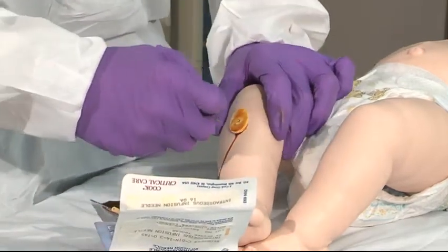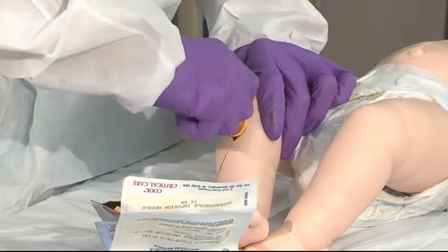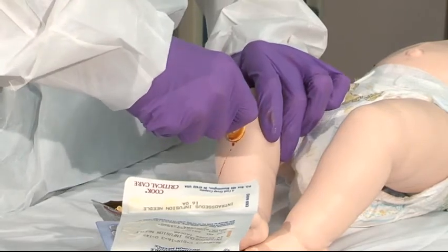Introduce the trocar by using a drilling motion back and forth, firmly going through until you feel the needle pop through the cortex.